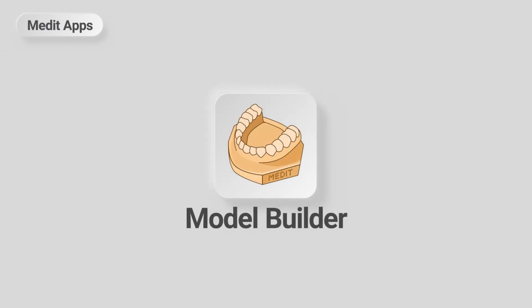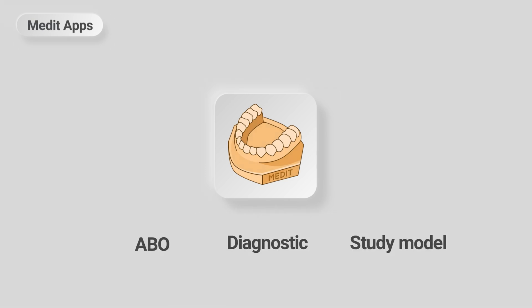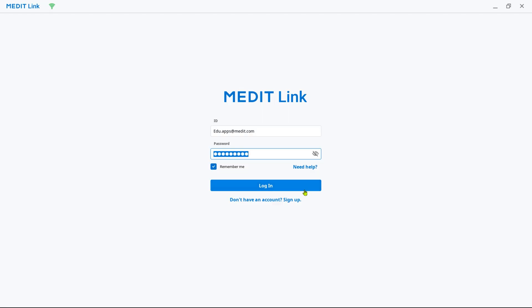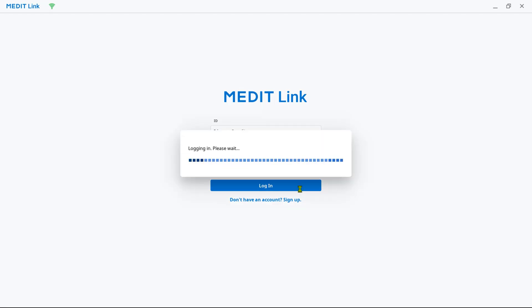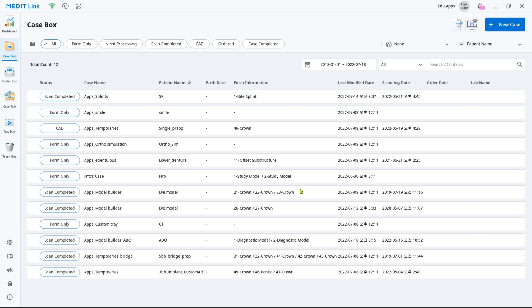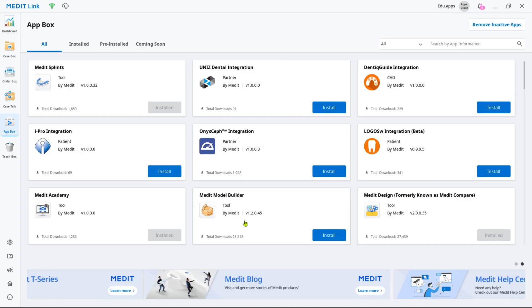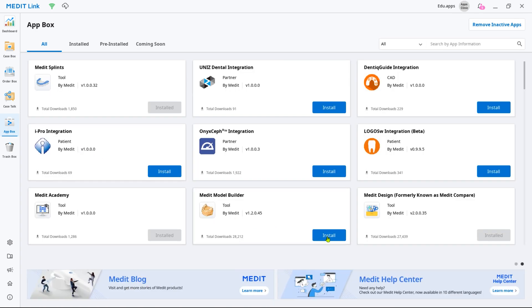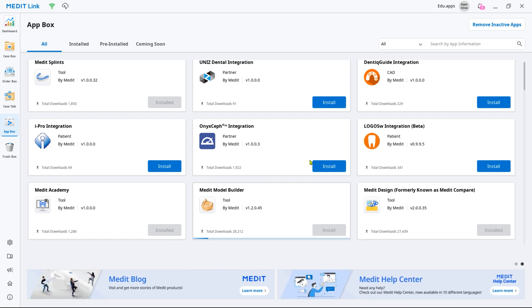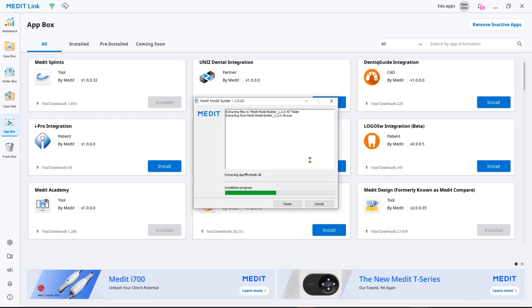This is a quick guide on how to design ABO models for printing using the Model Builder app. First, let's install the app. Log into your MeditLink account and go to App Box. Then find Model Builder and click Install. The installer will run automatically.